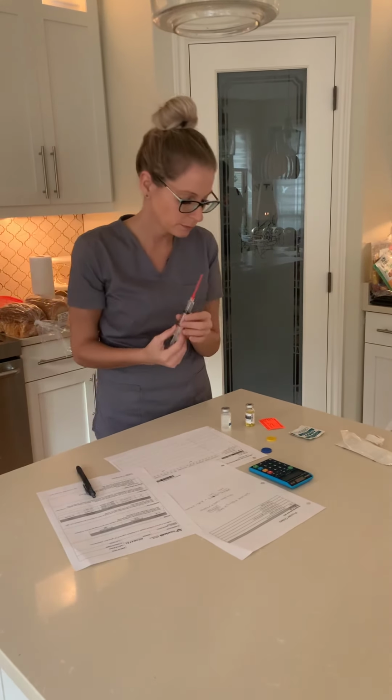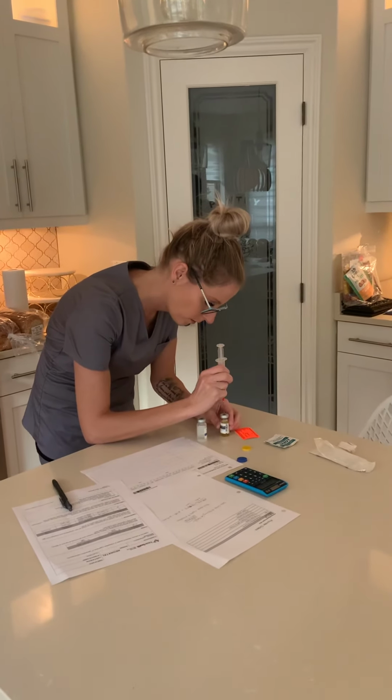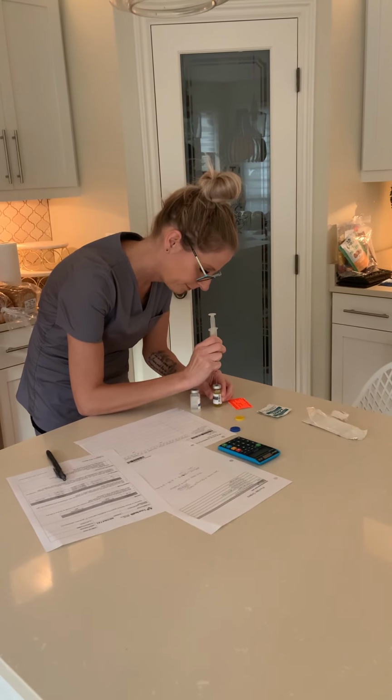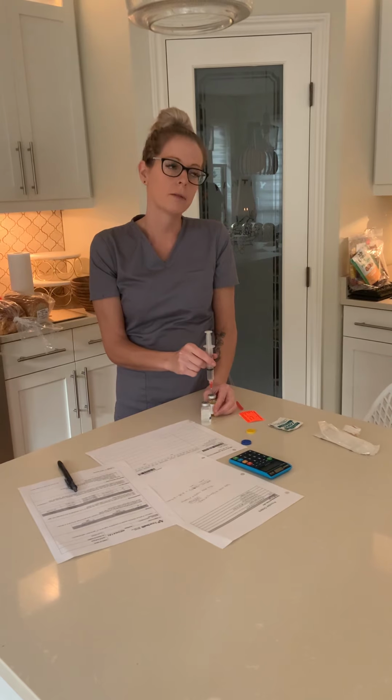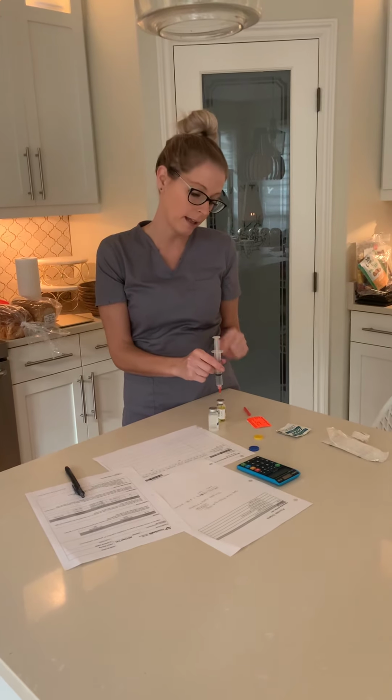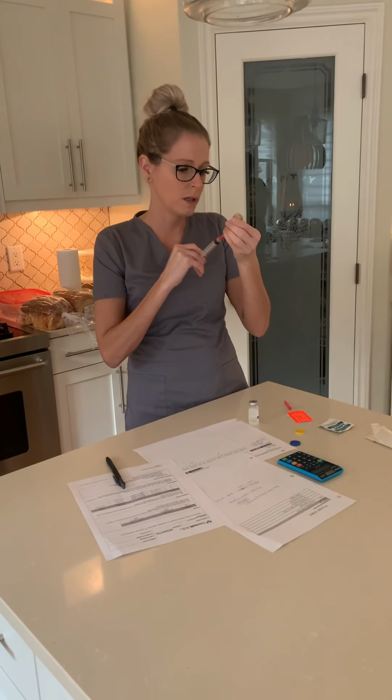Of air. Okay. I am going to try and put it into the same hole. There we go. I probably would have alcohol swabbed that before I did that, just in case, because I did roll it. I feel like I probably should have alcohol swabbed that. I'm thinking now, so that is something I would have done for sure, just in case I would have touched it when I was rolling, just to make sure that everything does remain sterile as possible. So I've injected the air in and I'm going to just draw back.